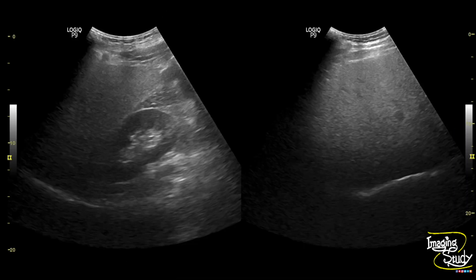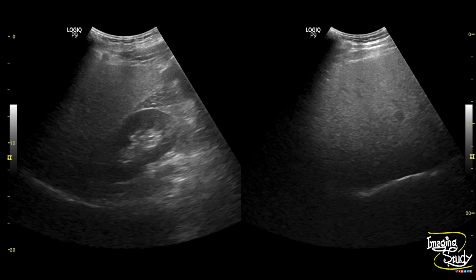Here is the picture of the right lobe of the liver showing increased sound attenuation causing distal darkness, and you can see the vessels and diaphragm, but these are impaired in visualization.